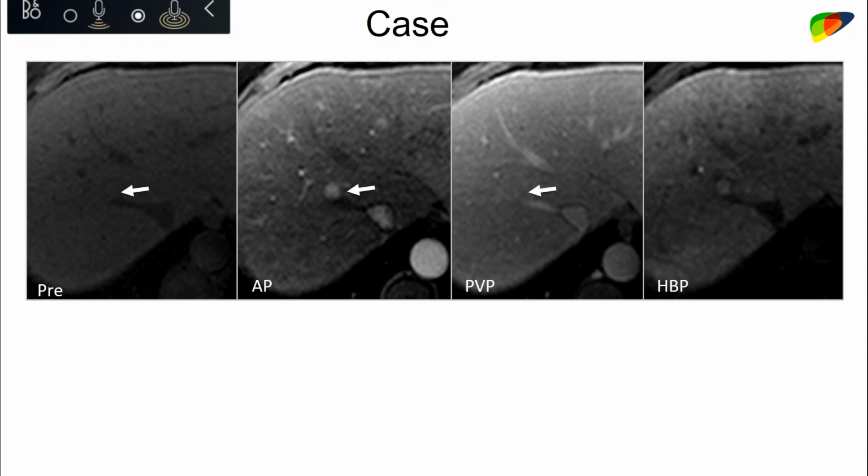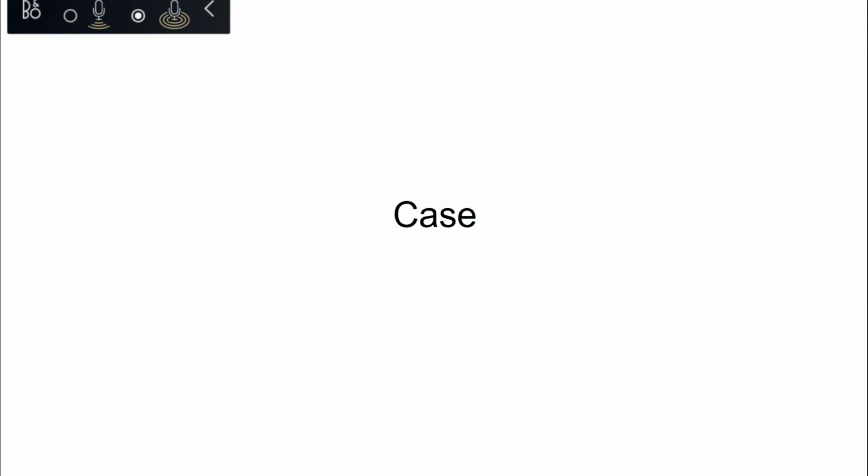I don't know if I got it right, but you showed a hypointense nodule on hepatobiliary phase that didn't have hyperenhancement in the arterial phase. And usually I classify these nodules as LI-RADS 3, but you said something about LI-RADS 2, and I got a little confused.